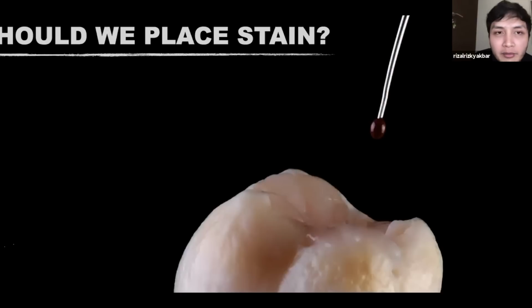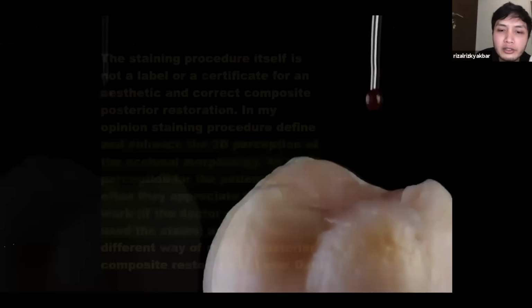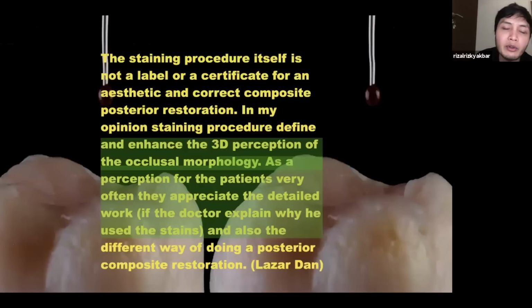And how about the stain? Should we place a stain? According to Lazardan, one of the members of Stato Italiano, this is not a mandatory procedure. But if you can use stain to enhance the morphology, the anatomy, the natural look, why not, right? And for me, stain also has a function to cover all the gaps that you already created when doing carving.